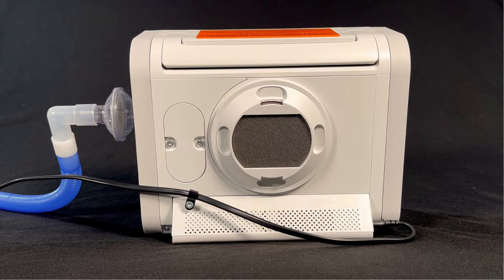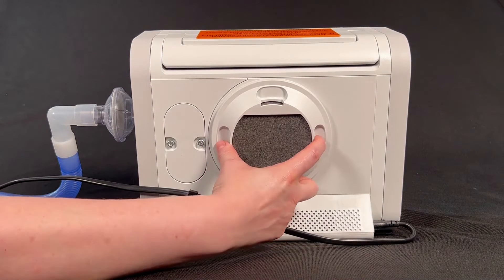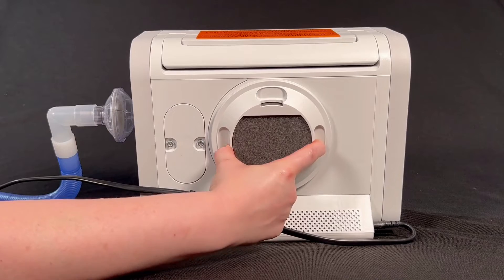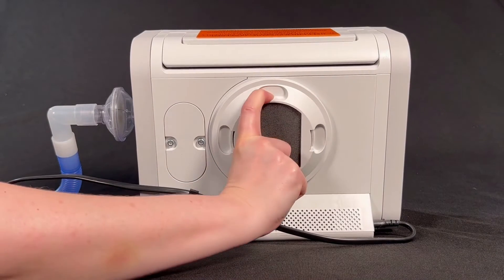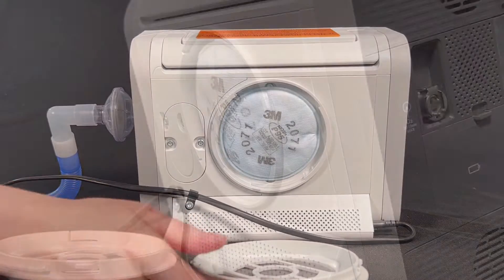To change the particulate filter in your Trilogy Evo Ventilator, you must first take the old filter out. Find the filter cover with the black foam filter in it on the back of the Trilogy Evo. Put your finger and thumb in the notches on the filter cover. Twist the filter cover a quarter turn to the left and pull it straight out to remove it.